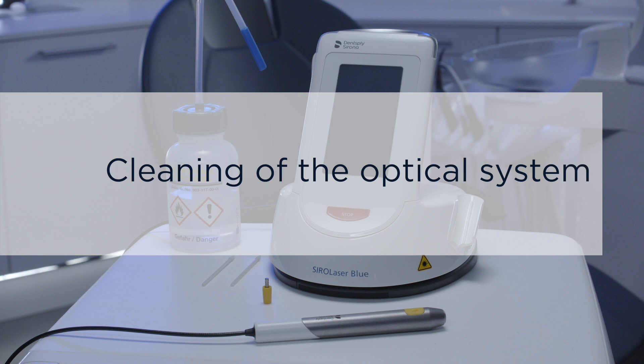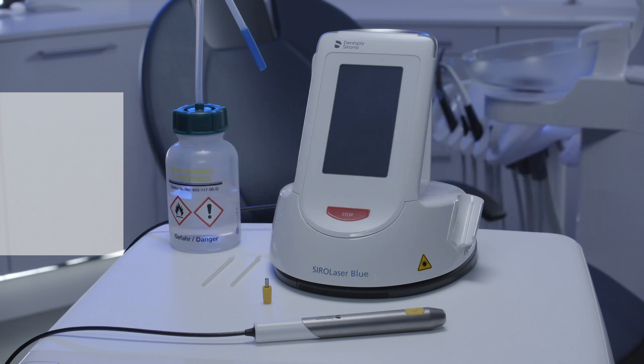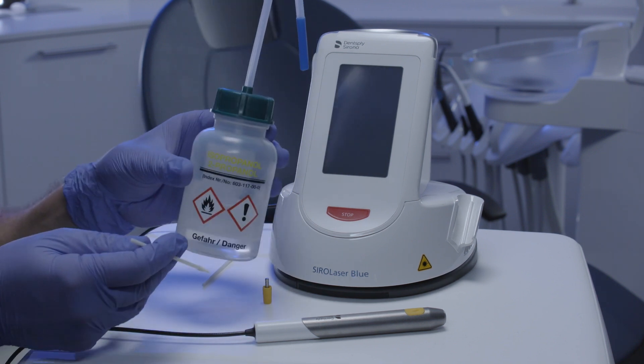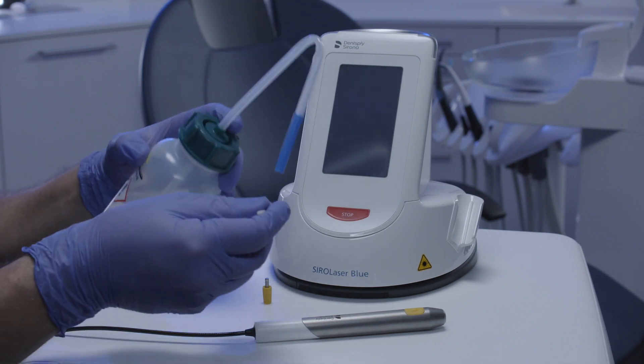Use a commercially available lint-free cleaning swab — for example, for cleaning a camera or CD player lenses — or the official Dentsply Sirona cleaning sticks, and moisten it with a little bit of isopropanol.